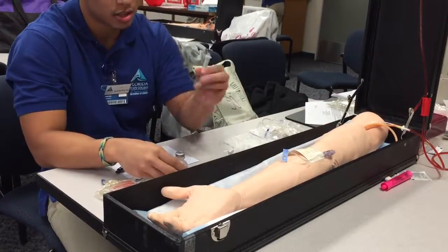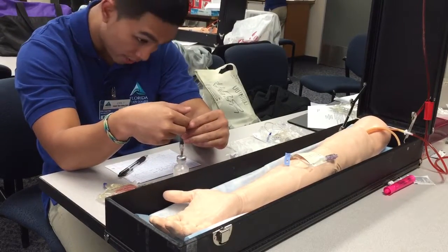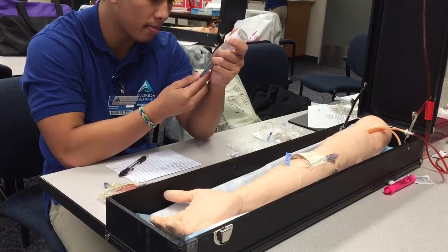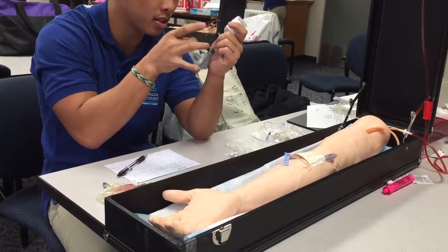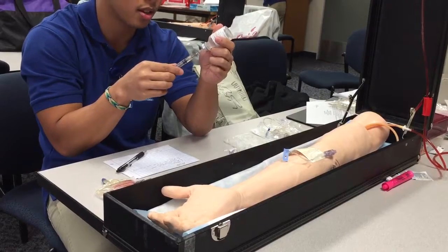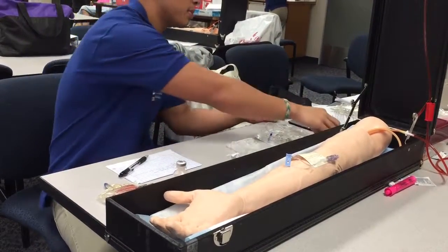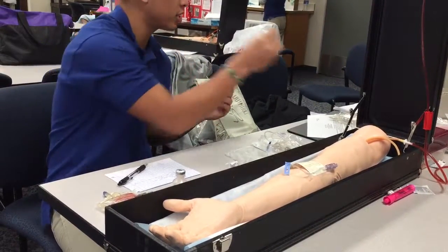Go ahead and stick this in here. I'm going to inject the 0.5 milliliters of air into there, and then pull the 0.5 milliliters up. I'm going to make sure all the air bubbles are out to ensure that is the correct amount. That's good. I'm going to take this off. Normally you would never recap a needle, you would dispose of it in the sharps, but for this purpose I'm going to use the scoop method, and then take this off. That can go in the sharps.